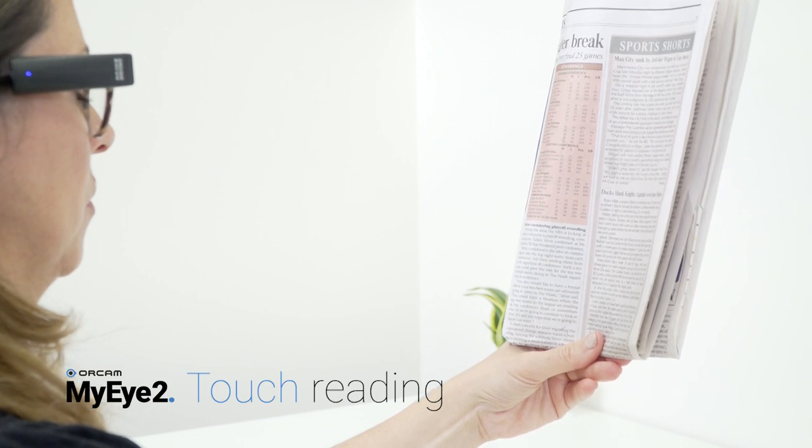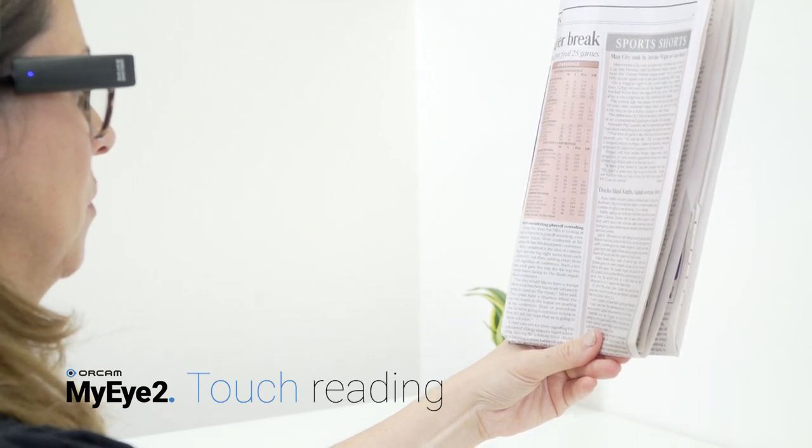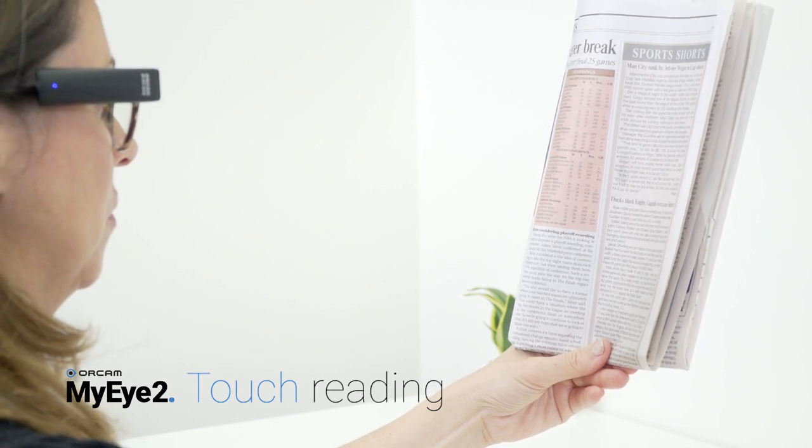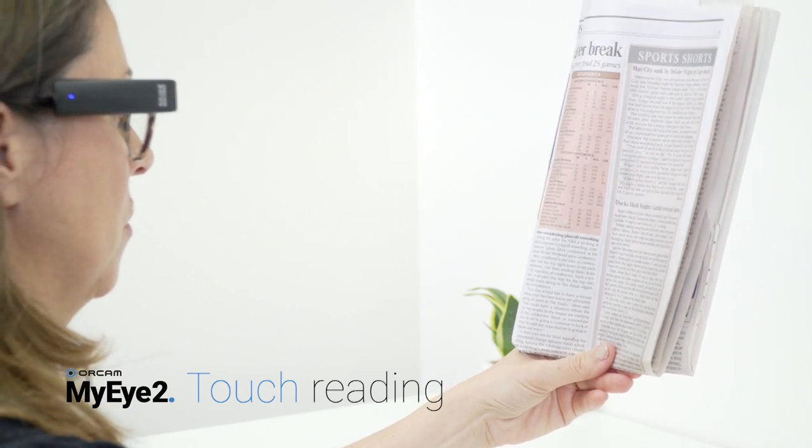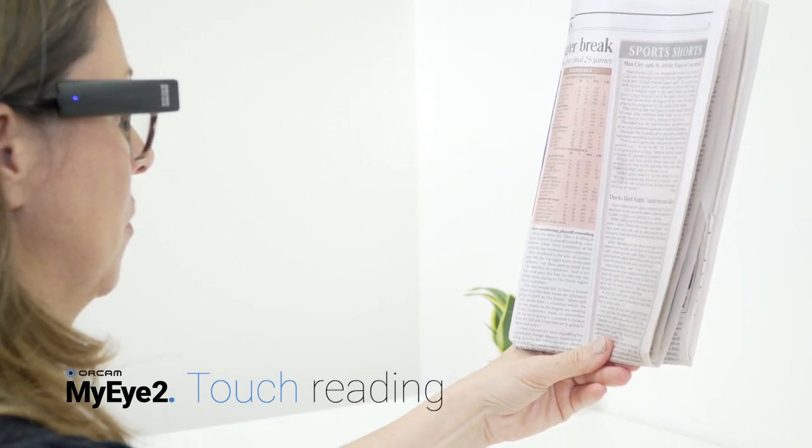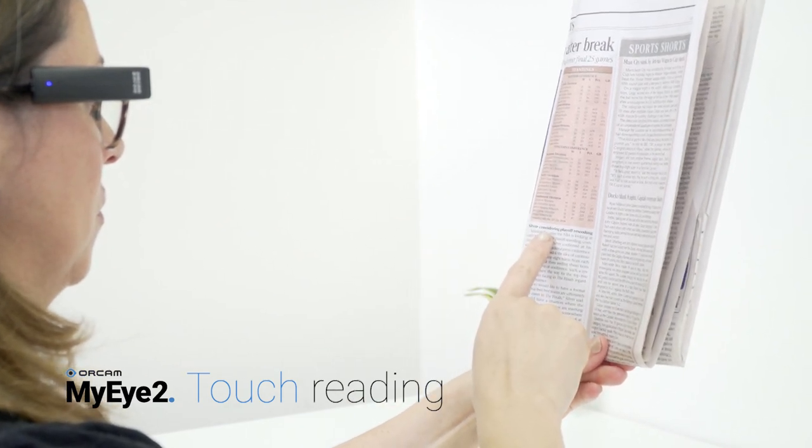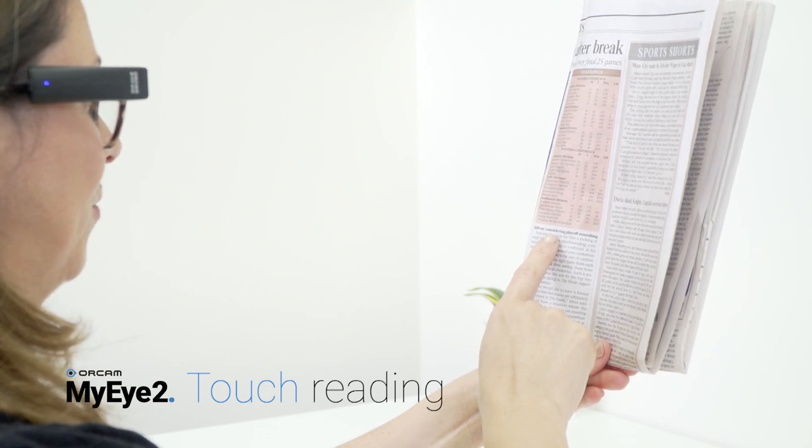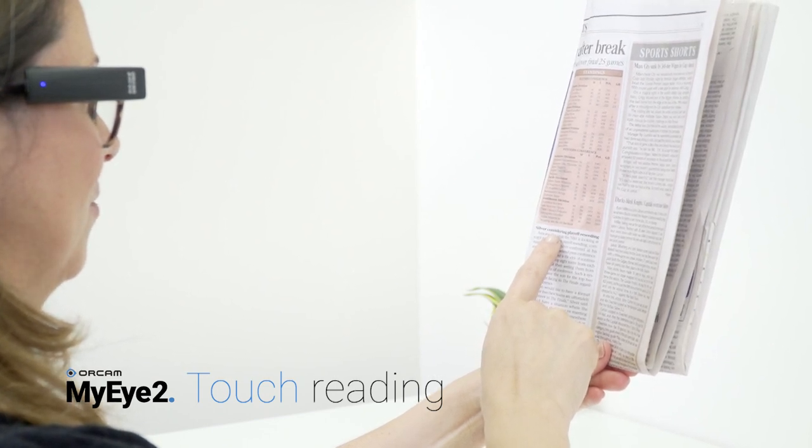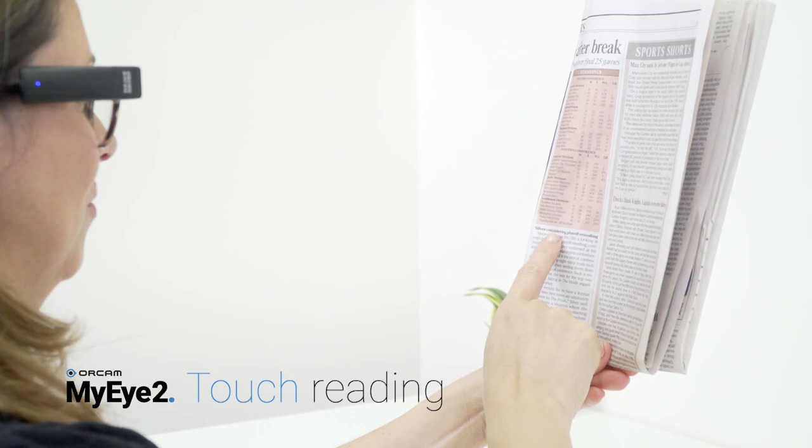Touch reading for when you wish to read a certain newspaper headline or a menu section. Face the text you wish to read and hold it steady. Point and hold your finger directly under the text you want to read, using the pointing gesture, until your OrCam device beeps twice. The device will start reading about three lines above your finger.